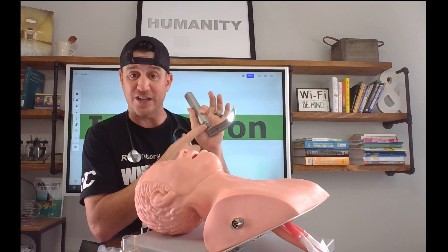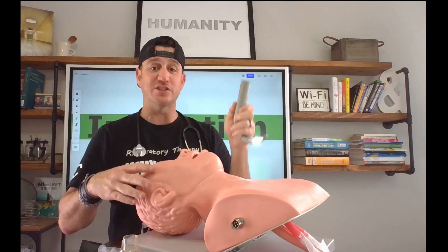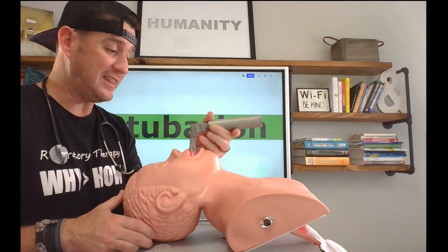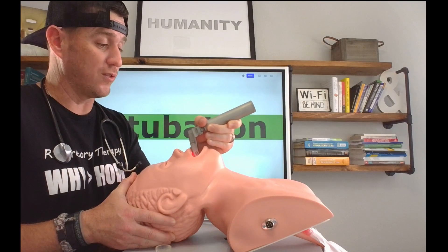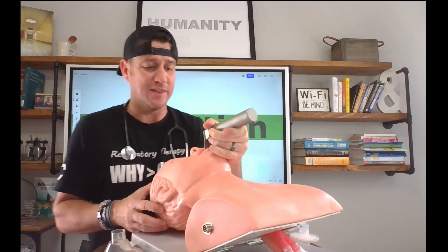Remember, I'm using my Macintosh. The Macintosh goes into the vallecula and indirectly displaces the epiglottis so that I can see the glottic opening — I should be able to see the vocal cords to insert the endotracheal tube through. As I go to insert this into my patient's mouth, I'm going to start on the right side of their mouth and sweep towards the middle. At this point, I am visualizing the oral cavity — I see the base of the tongue and I see my patient's epiglottis. The key thing here is I'm not cranking back like this — I'm going in until I'm positioned and then raising up this way. The action is up and towards the corner of the room, not back, because this will tear up your patient's teeth, and that's not what we're here for.